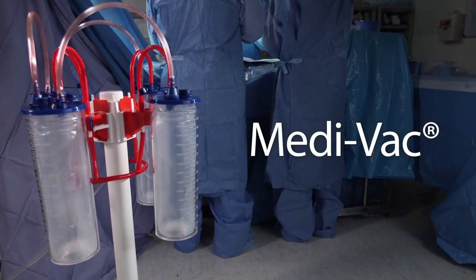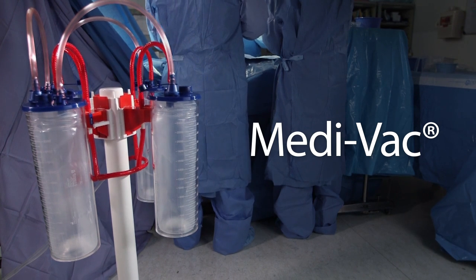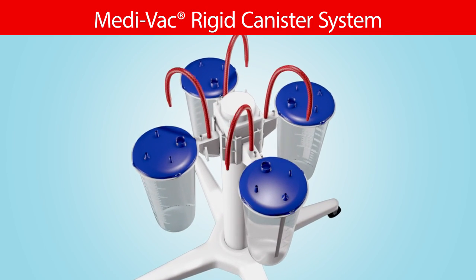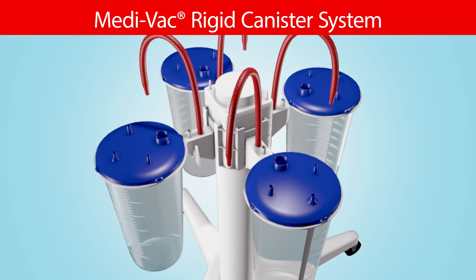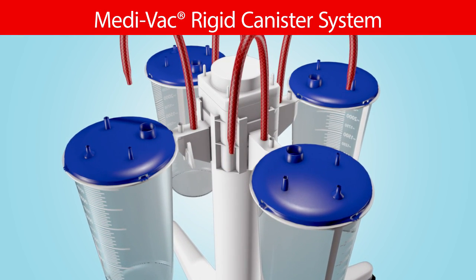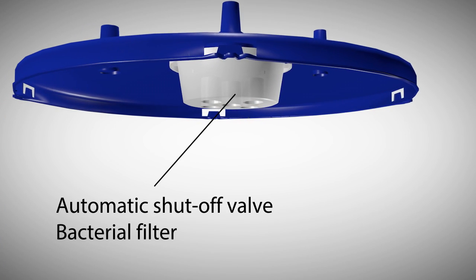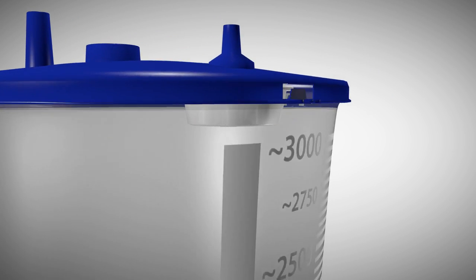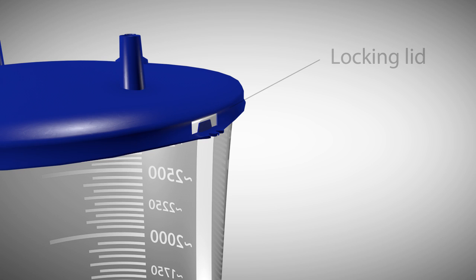Medivac, a global leader in fluid management. The Medivac rigid canister system features disposable, hard, clear plastic containers with attached lids. An automatic shutoff valve and bacterial filter is located inside the lid to help prevent cross-contamination of regulators and wall vacuum outlets. The locking lid encourages the proper disposal of infectious liquid medical waste and enhances staff safety.